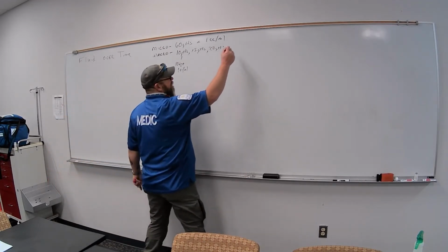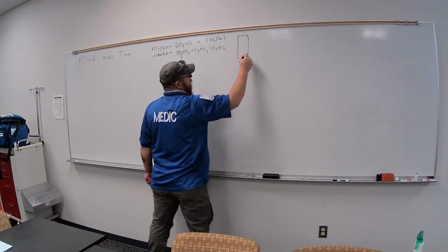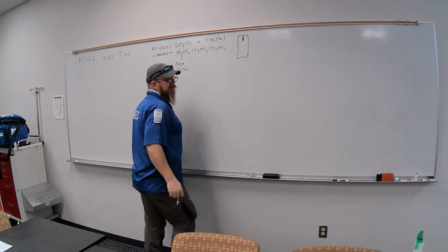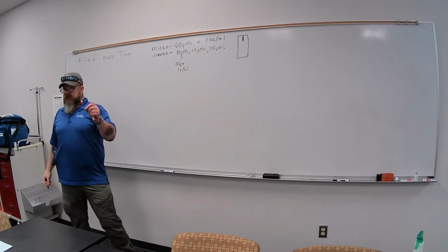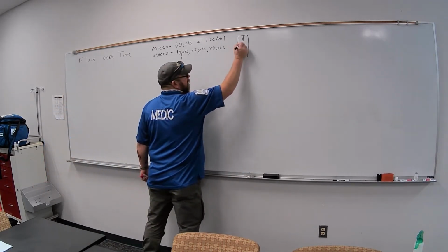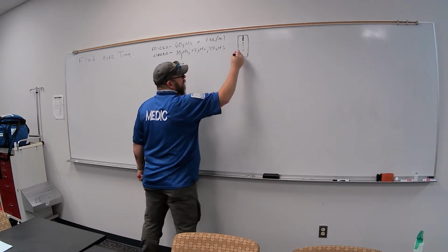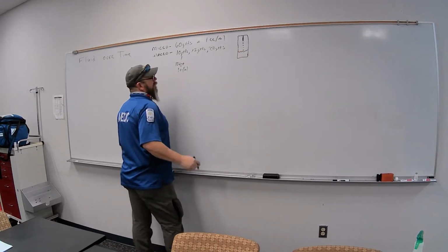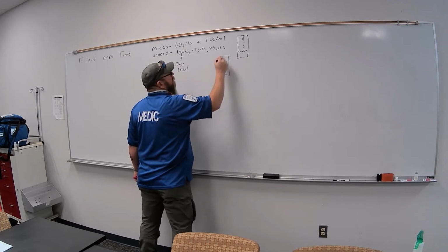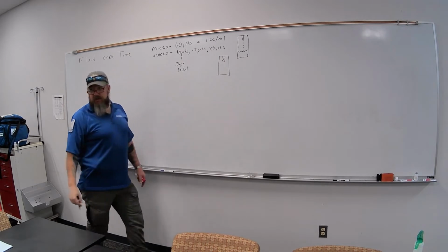So in a 60 drop set, you've got your drip chamber here, and you've got a little needle here. The little needle is to reduce the size of the droplet, so these are going to be little drops, and then your fluid chamber here. In a 10 drop set, you've got this here, and the drops are bigger.